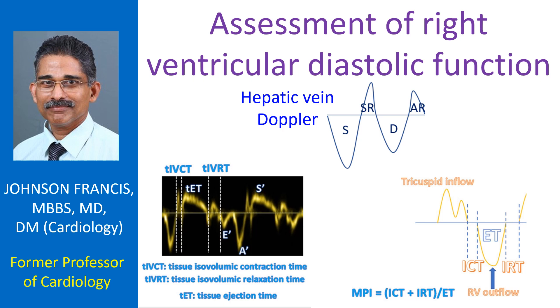The left ventricular outflow tract should not come into view and the left ventricular apex should remain at the top of the image sector. In this adjusted view, the entire right ventricular free wall should be visible.